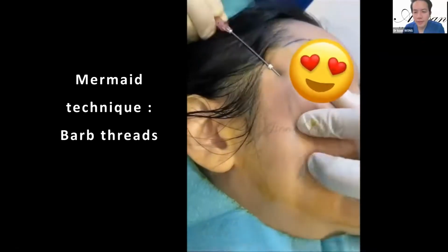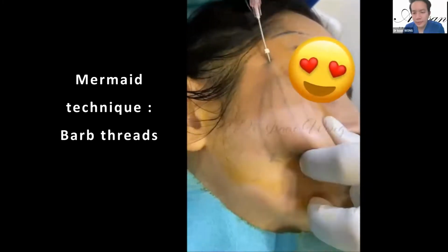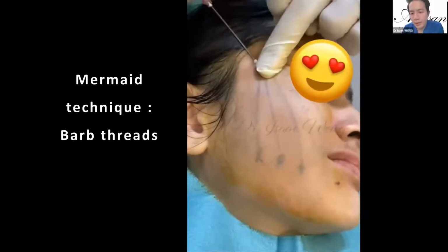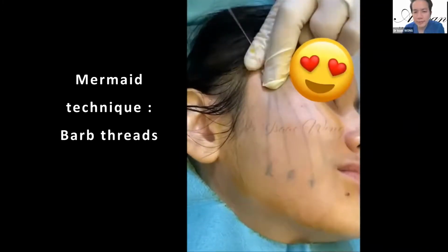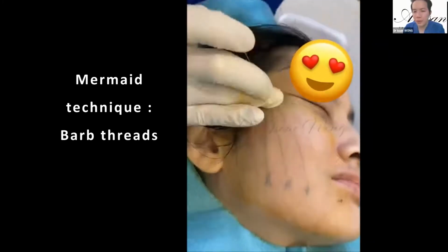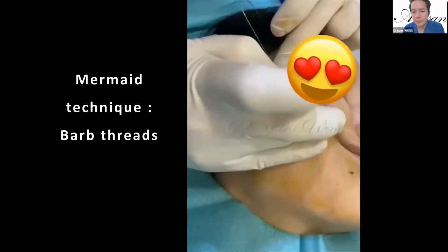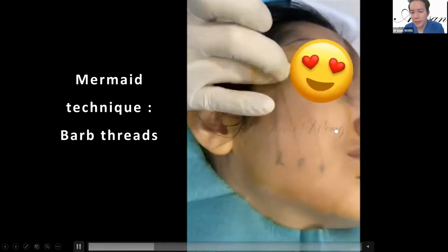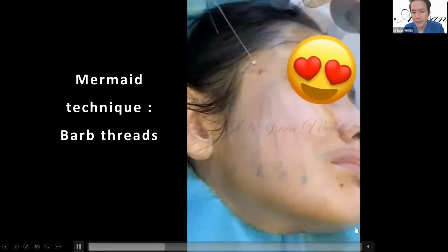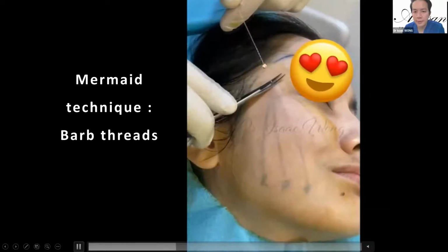We go deep first, and then we go subdermal, and then we do a hook into the layer 2 fat. We drape it up a few times, pressing it down onto the hooks. You can see that immediate lifting at the nasolabial area already. Okay, cut it.